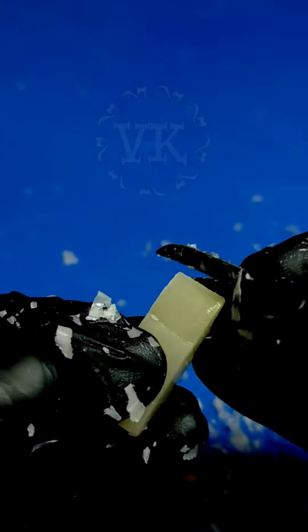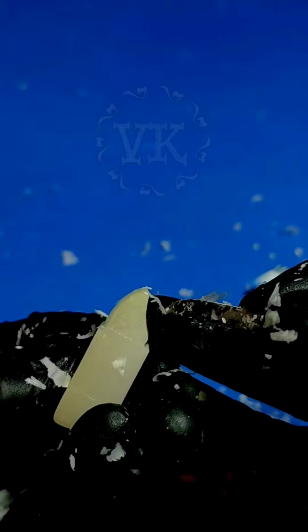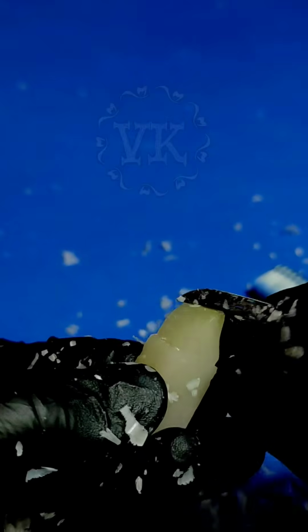Almost done. Still a little bit more wax left behind. Please notice I'm using only the back side. I'm not using the convex side. If you use the convex side, you will lose a lot of wax and there won't be any convex surface. You will have concavity. So when your instrument is convex, the surface that it creates will be concave. If your instrument is concave, the surface that it is creating would be convex. You can also create flat surfaces and curved surfaces using a flat surface by just moving around like this in a circular motion.